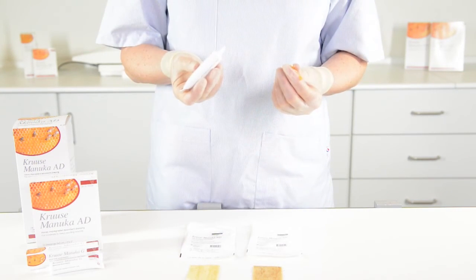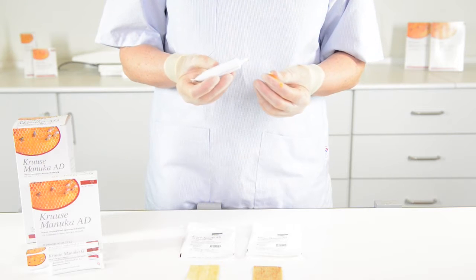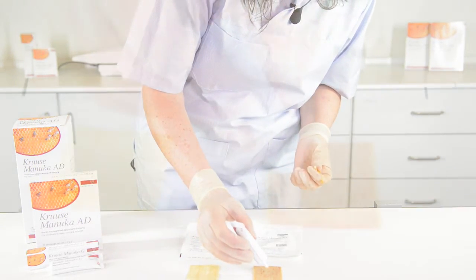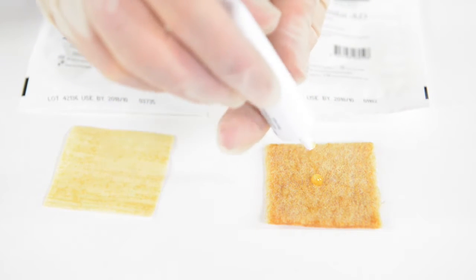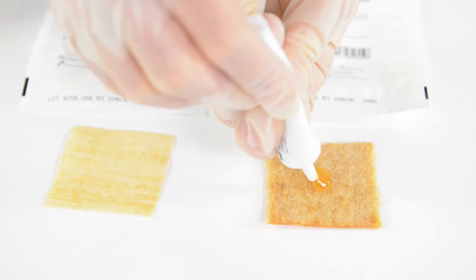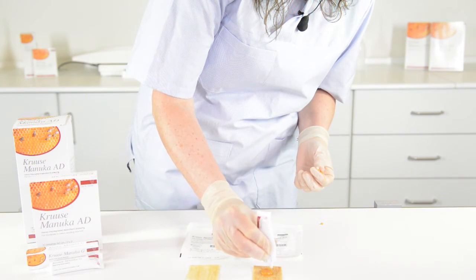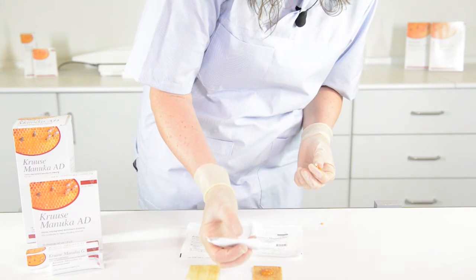To create even further contact with the honey, you can fill the cavity with additional honey. You simply pour it out of the tube and into the cavity of the wound.